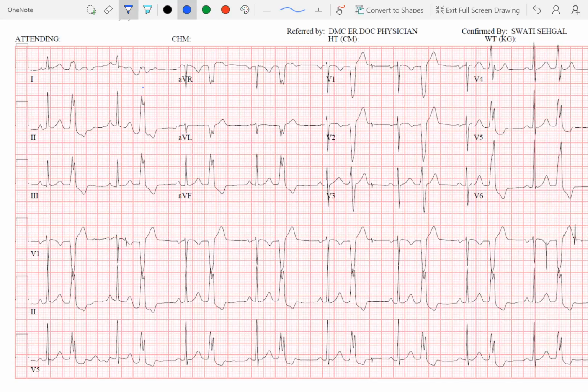Okay. In this case, I think these PVCs are coming late enough. And you can also look at the morphology of the PVCs to see if they are coming from the septum or the free wall. And in this case, you see that the precordial transition usually happens pretty late. It's predominantly negative in V1. It starts becoming mostly positive in V4. Okay. That's not an early transition. That's a later transition. On the other hand, if you saw a PVC that was negative in V1, completely positive in V2, or mostly positive in V2, that would be an early transition.